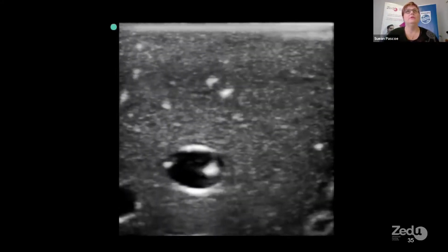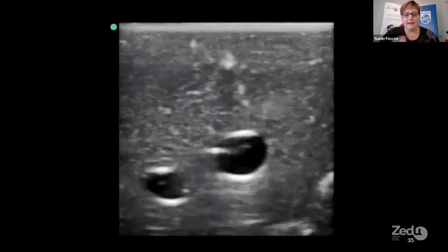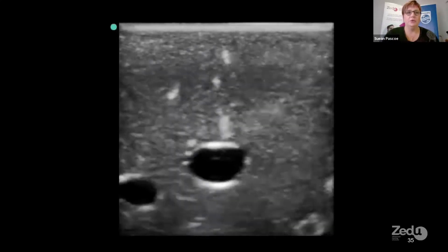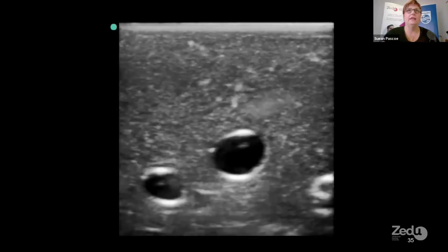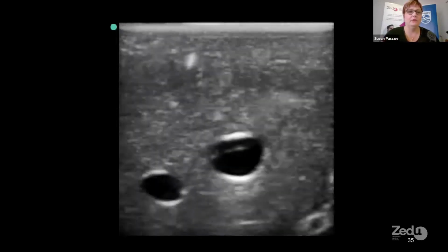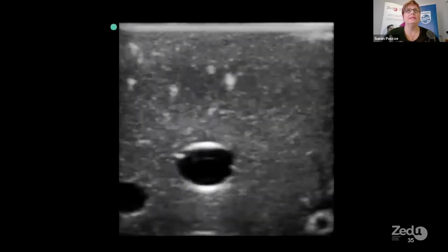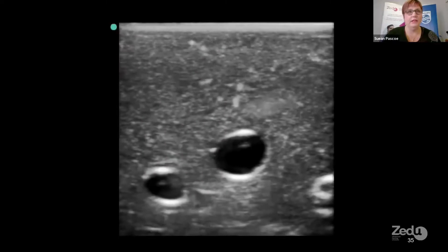The reason for doing this is when the needle is out of plane, it will be echogenic anywhere along that path. And you want to make sure you have the tip, and not that you've advanced the tip well past your target and that you're looking at the shaft of the needle. So we need to advance the probe in front of where the tip is so that we see that tip come into view and we know it's the tip of the needle and not the shaft of the needle.